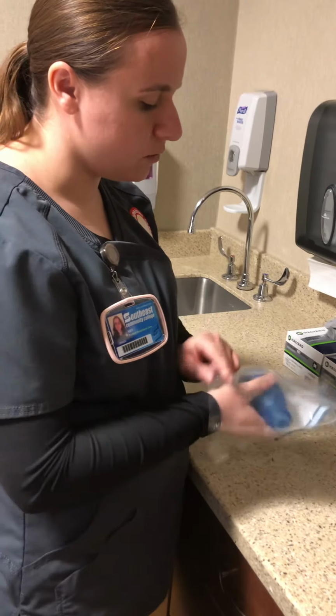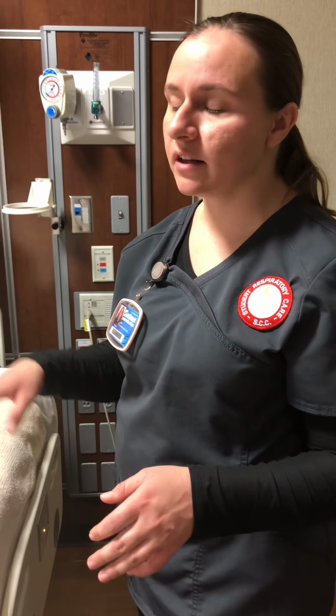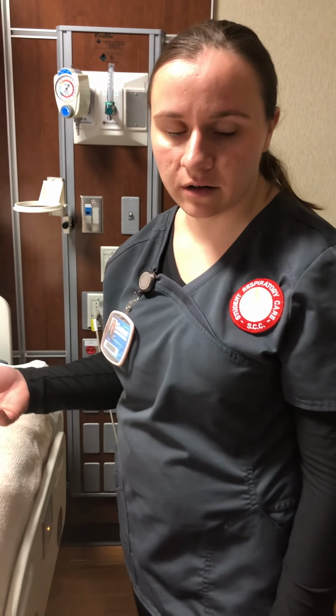And then I would wash my hands after any treatments that I do, and then I would put my gloves on, and then I'd reassess the patient to auscultate their lungs, get their vital signs, and see how they're feeling, if they're feeling faint, if they're conscious enough, like if they sound kind of disoriented. I need to make sure I chart that and see what's going on. And as always, if I do a breathing treatment, if they had a mask on or anything, I always need to make sure their oxygen is at the appropriate level.